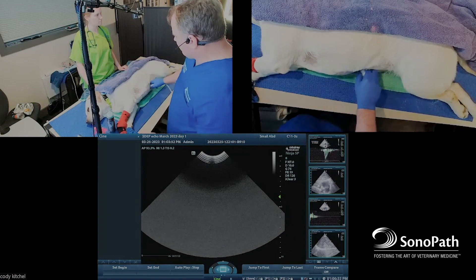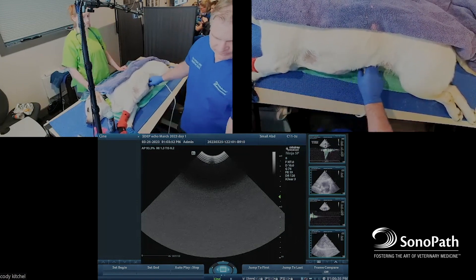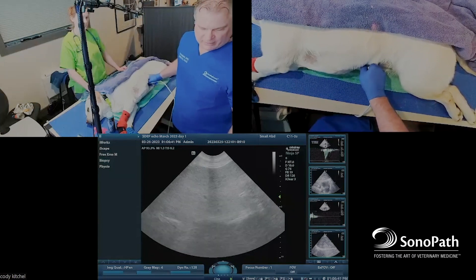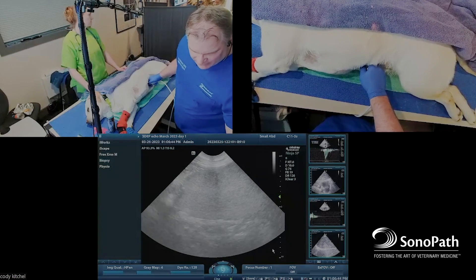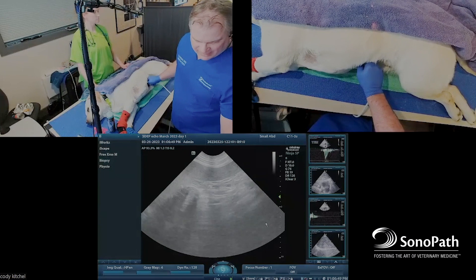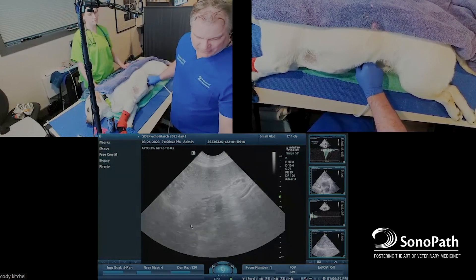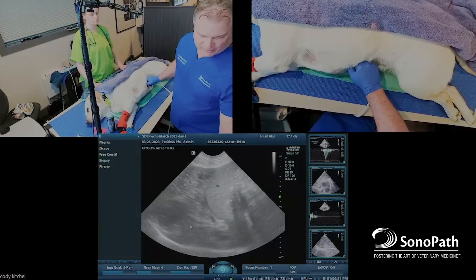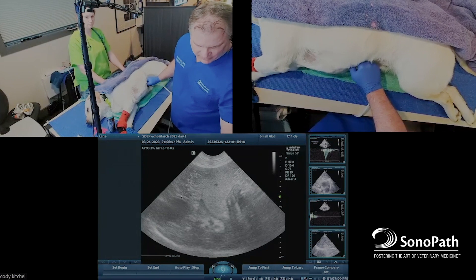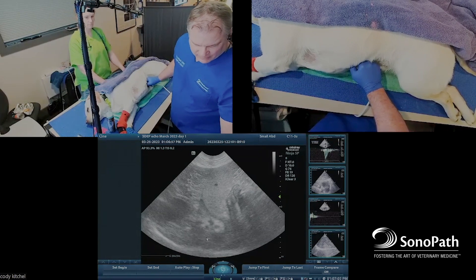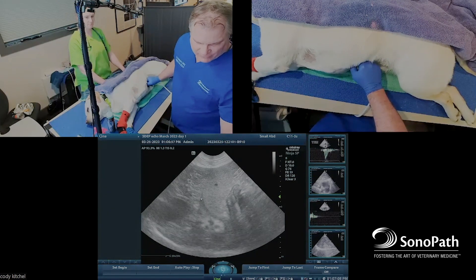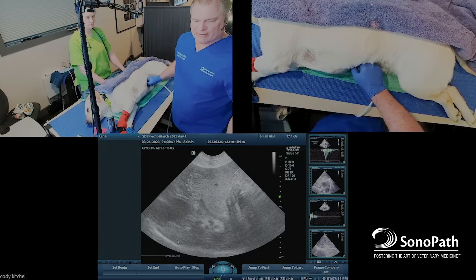This is Kira, a 60-pound Labrador. As you can see on screen, I can scan her spleen nice and easy. I have 10 centimeters of overall depth, but my diagnostic quality in this position is about 7 to 8 centimeters without even pushing. Moving up to the liver — she has a little bit of a beat-up liver, slightly lumpy with some gallbladder edema — you can see all the way down to the diaphragm at about 10 centimeters with pretty decent solid resolution using a micro-convex probe.